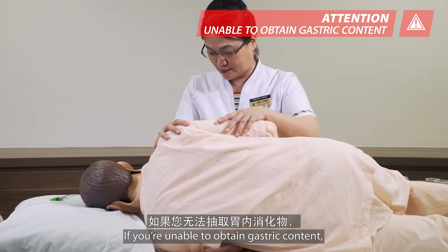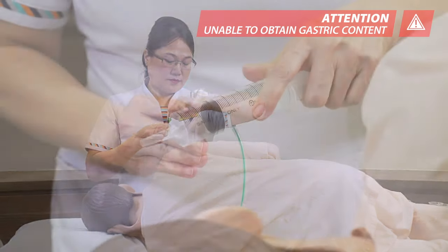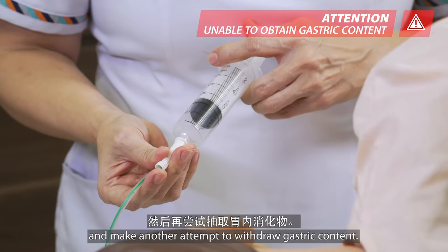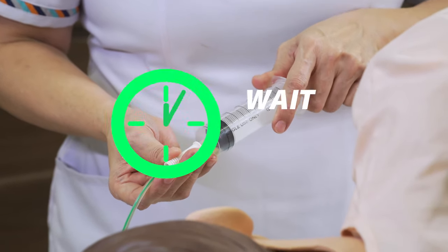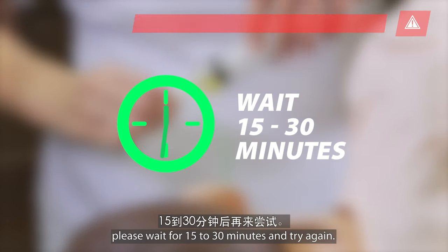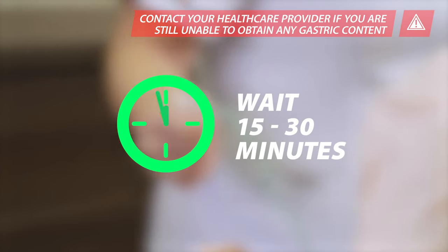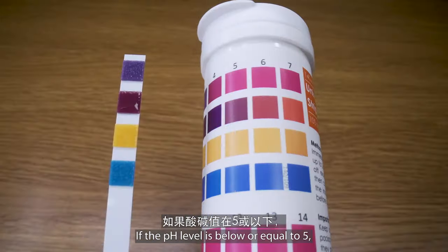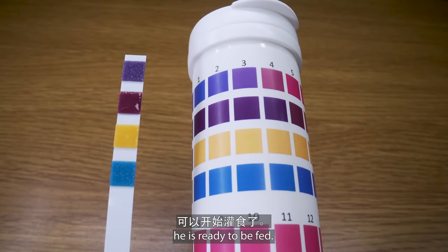If you are unable to obtain gastric content, lie the patient on their left side, inject 10 to 20 ml of air into the tube, and make another attempt to withdraw gastric content. If you are still unable to obtain gastric content, please wait for 15 to 30 minutes and try again. Read the gastric content pH level. If the pH level is below or equal to 5, the patient is ready to be fed.